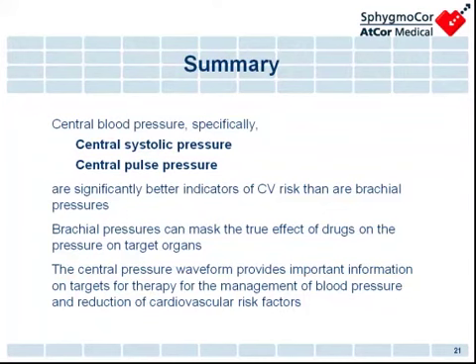So central pressure waveforms provide important information on targets for therapy, for the management of blood pressure, and reduction of cardiovascular risk. And I think that that's very informative. Again, a non-invasive way to monitor our patients. Very simple, but I think very elegant to show improvement. Or if we're not improving, we can change our algorithm and our management.